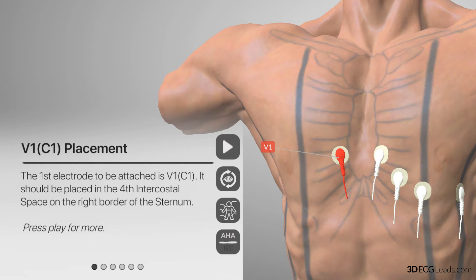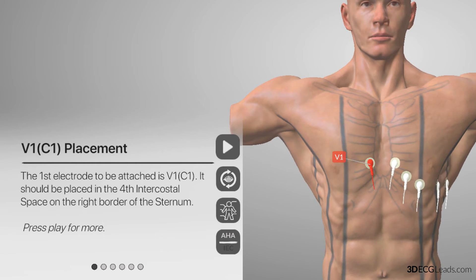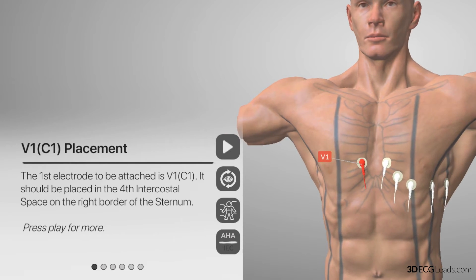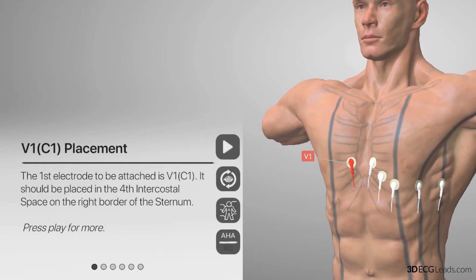The first lead you have to place is chest lead V1, and it is located in the fourth intercostal space on the right border of the sternum. To have a better view or understanding of this, we need to look at the anatomy.